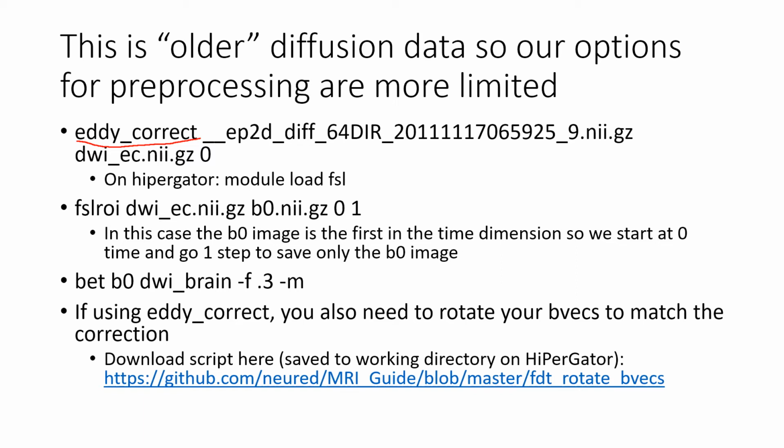Again, as I drew, if you have a stream with a little rock in it and the water's flowing down, you end up with these little eddies and little swirling things.